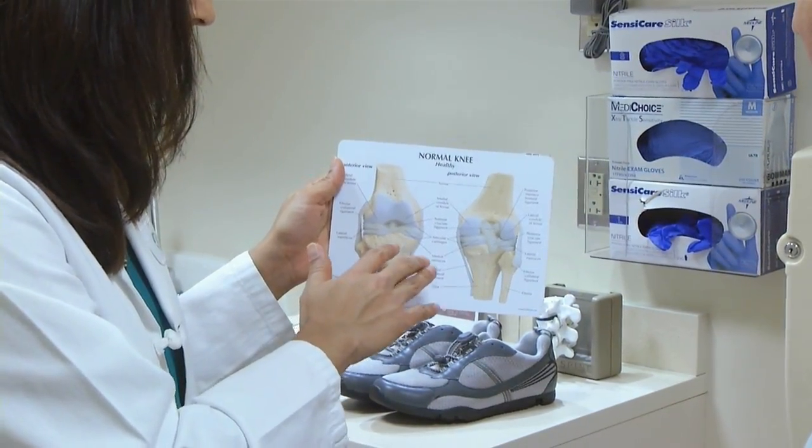For years, shoes have been engineered for the feet. We have made shoes to provide comfort to the feet. And really, nobody thought about the fact that our whole lower extremity is connected. Our foot is connected to our knee and to our hip, so anything we put on our feet probably affects the rest of us. It's just recently that we started paying attention to what our shoes are doing to our knees, especially when it comes to something important like osteoarthritis.